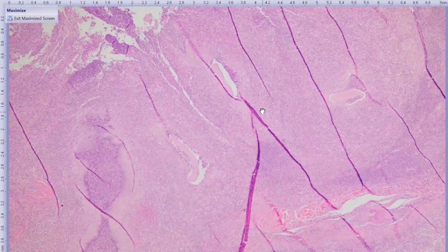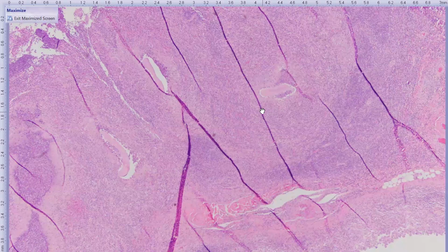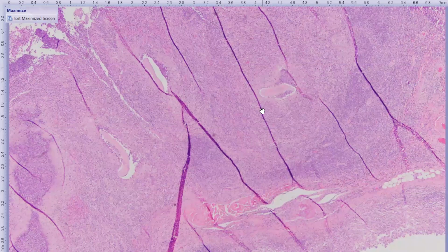So nematode parasites that are living in this anatomic region with those annular cuticular ridges are most likely going to be Onchocerca. The interesting thing is that this cat came from the Pacific Northwest, which is not an area that should have Onchocerca parasites locally, at least. It typically occurs in dogs, first of all. So this is a cat, don't forget. So this is really kind of a weird case. This is a cat, and that was pretty unusual in our experience, at least. But it does occur. It is reported to occur in cats.